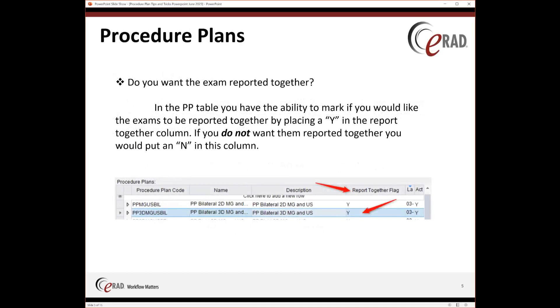Do you want the reports to be together? In essence, linked — same meaning. Basically, you would come into the table and mark the 'Report Together' flag as yes. If you do not want these two or three exams reported onto the same dictation, you would mark that as no.